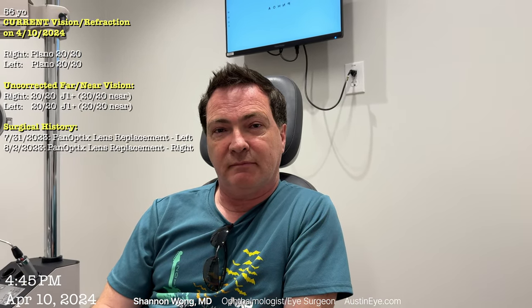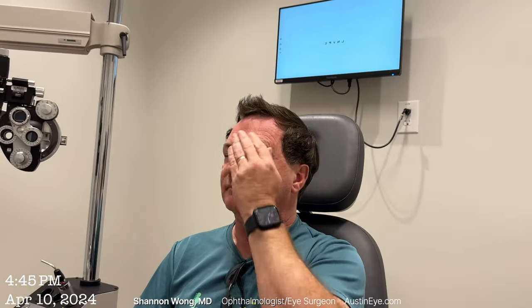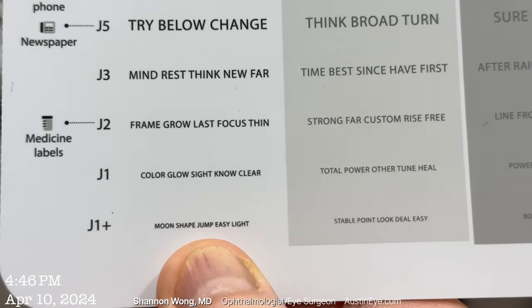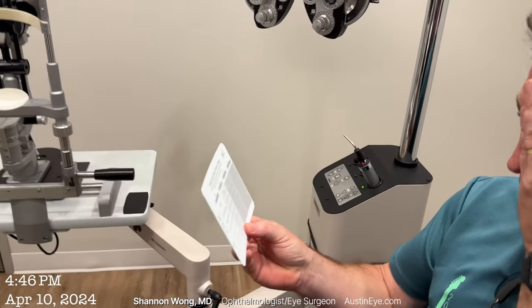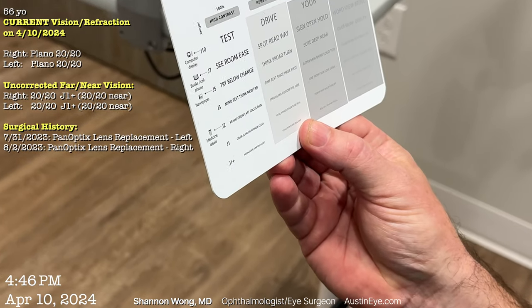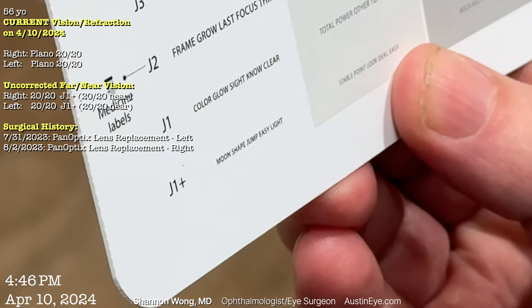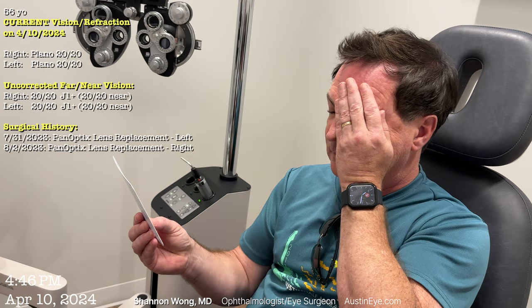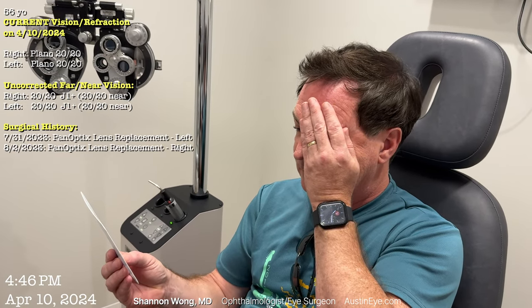So you had surgery with the Panoptix in both eyes last year, correct? That's right — August last year. And your vision is 20/20 far away and 20/20 close. That's 20/20 vision far away, and this is the 20/20 size print on this card. Reading the smallest size print: moon, shape, jump, easy, light. So you can read 20/20 from about 18 inches from your eye. You're 20/20 far and 20/20 near.